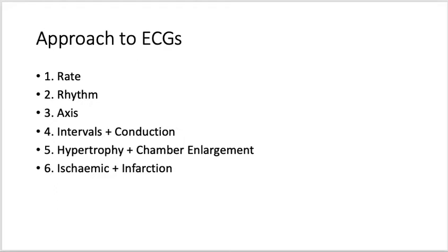But hopefully at least the first bit of the lecture can assist you in working on whatever method you use for interpreting ECGs, and maybe even having a look at it this way can give you a different perspective or different techniques to add to your interpretation method. What I want to focus on is being able to interpret what is normal and how to find things like the rate, the rhythm, and any axis deviation. I want you to be able to identify when those things are present.